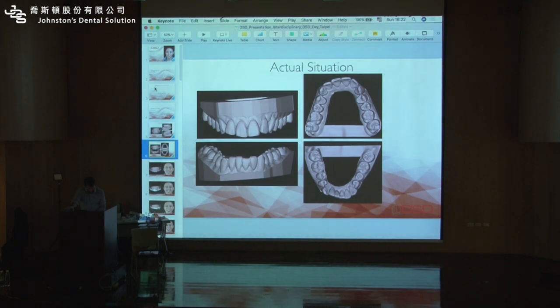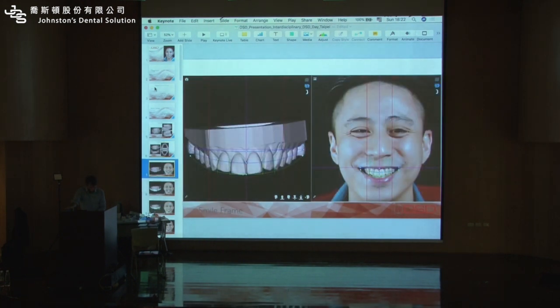Okay? So we have frontal occlusal images. These images with the lines are usually interesting to explain to the patient. Look here, for example. It's very easy to explain to the patient why a soft tissue graft here. Connective tissue graft would be interesting. Not only to protect the roots, but for aesthetic reason. Okay, here it's above. So these lines are very, very helpful.